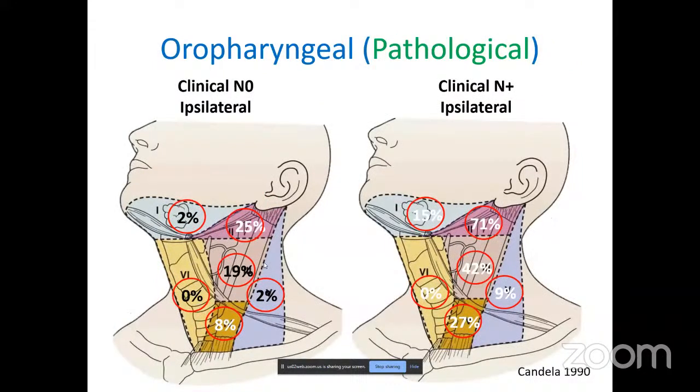And if it is pathologically node positive disease, then there is a higher chance of positivity of level 2, level 3, level 4, as well as sometimes level 5 and sometimes level 1b. And one important nodal station is the retropharyngeal node, especially when lateral pharyngeal wall is involved, when posterior pharyngeal wall is involved. It is important to include retropharyngeal node in your radiotherapy portal.